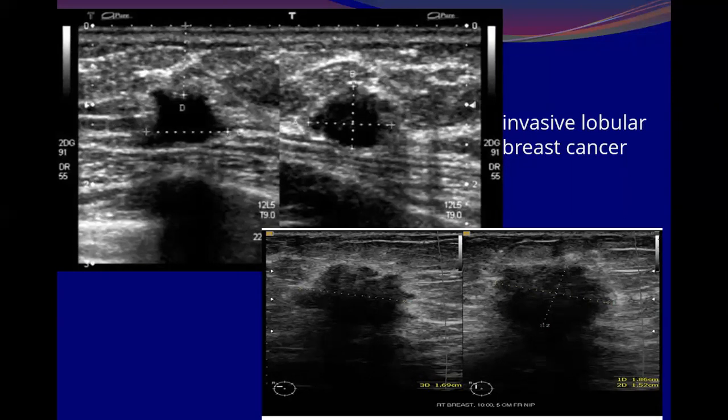Rehab, are you there? Okay, anyone who attended from the beginning: regarding the focal zone and the grayscale or dynamic range optimization, which one is more optimum?